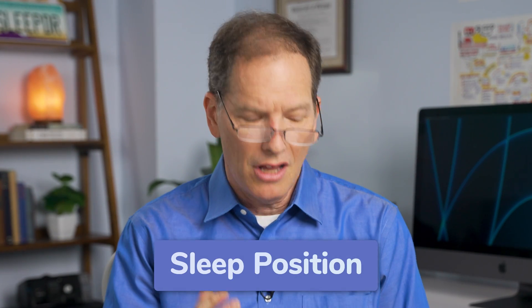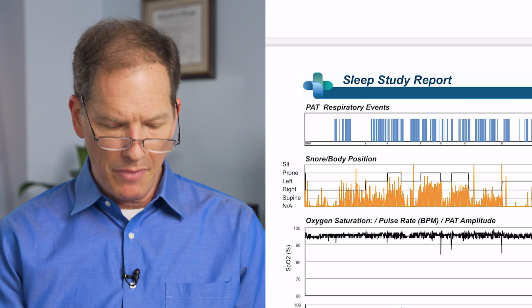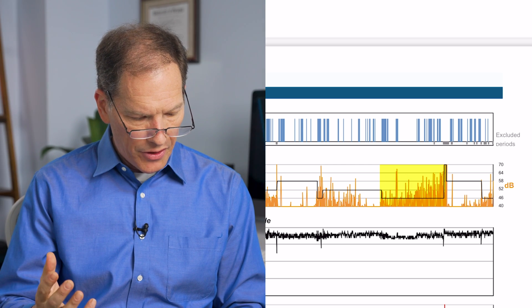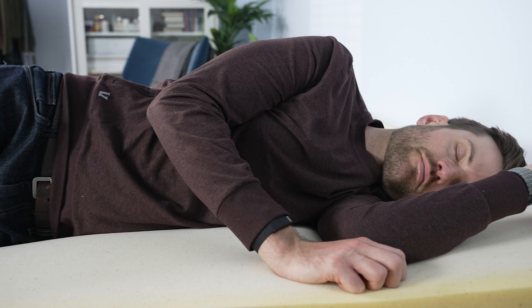The final thing we really want to figure out is whether this could have something to do with the position the person is sleeping in. When we look at body position, we try to see what's going on when people are specifically in the supine position, or lying on their back. You can see that in the last half of the night, almost all of the respiratory events and snoring occurred when this person was on their back — or when they're prone, meaning on their stomach. So if this person moved to their side, we would see almost the majority of their snoring disappear, and we might also see a majority of their apnea disappear. This could be considered a case of positional sleep apnea, where the person tends to have it on their back or stomach, but not necessarily on their side.